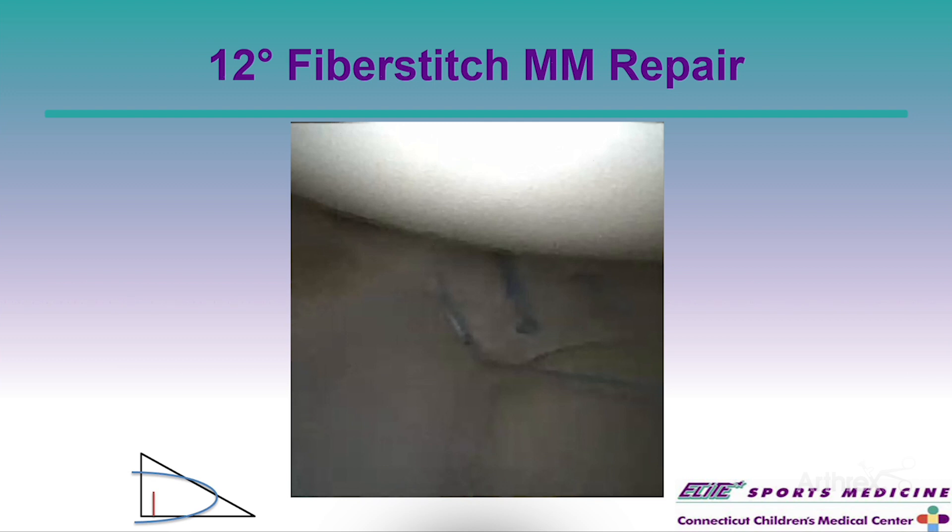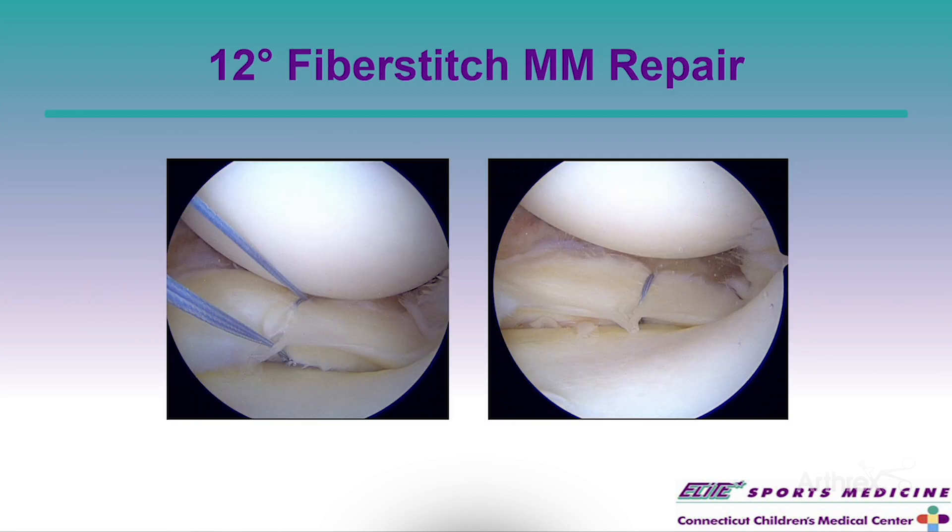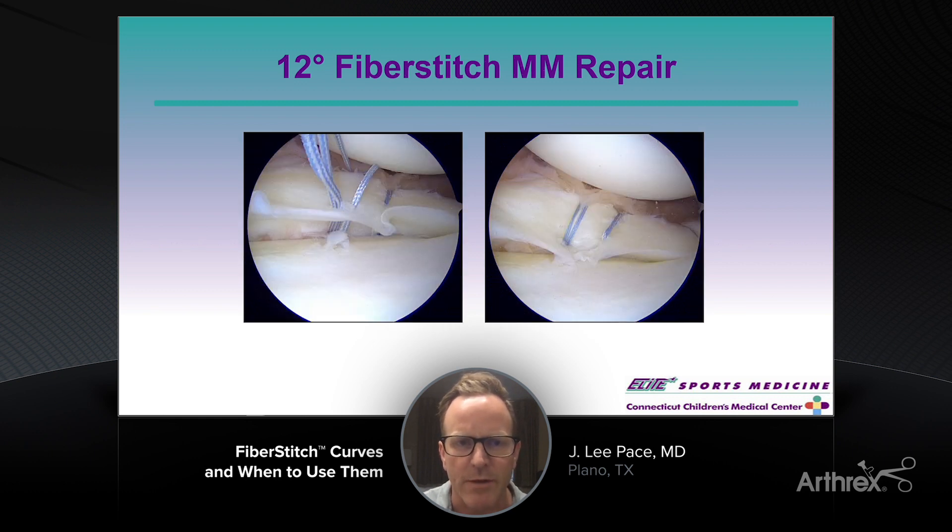You can see I've already placed two previous anchors there and was able to get a really robust 360 compression to lock out synovial fluid for this very common undersurface tear of the medial meniscus. Here's another example - a full thickness tear in the same location, all the way up to the superior surface, posterior horn meniscus tear. I was able to fix this using the same technique with the standard 12-degree curve. You should fenestrate the MCL if you're having access problems, though the 24-degree curve may help with that.